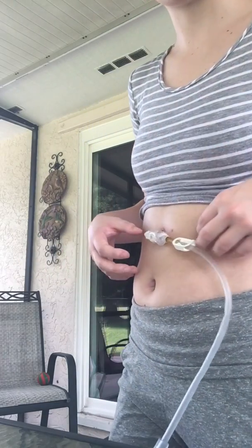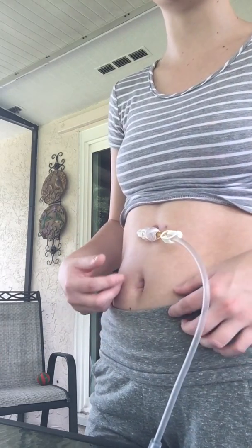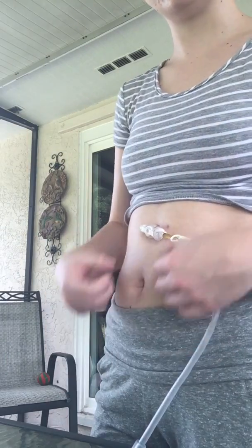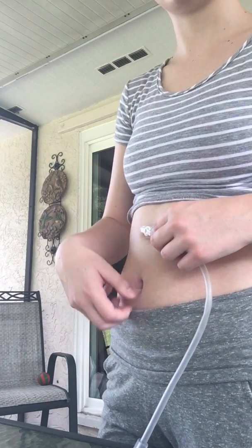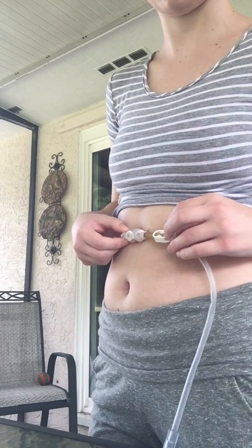But a lot of times when there is anything in my stomach or in my intestines and it's trying to digest, it will move the tubes with it. So as right down here it's starting to digest my formula, it'll move it in and out like this and make it pop, which sometimes can be painful and sometimes can make me nauseous, but most of the time it doesn't. It's just an odd, uncomfortable feel of it popping, so it kind of feels like a little kick. I keep telling my mom, it's like I'm pregnant and feeling the kicks without actually having a baby. Yay.